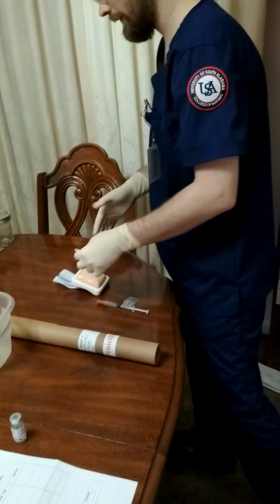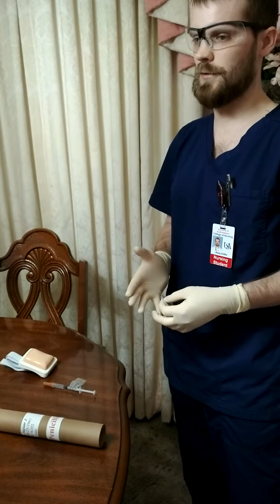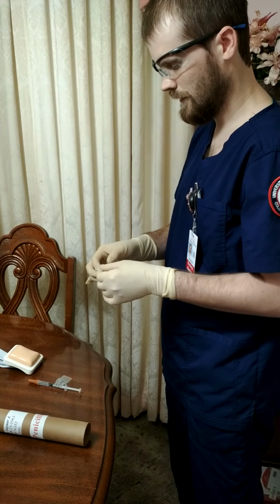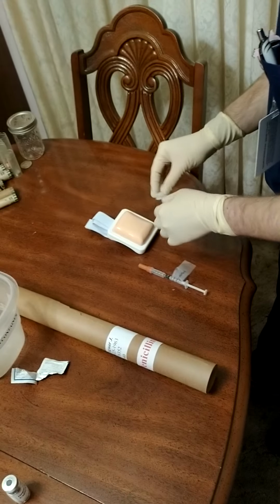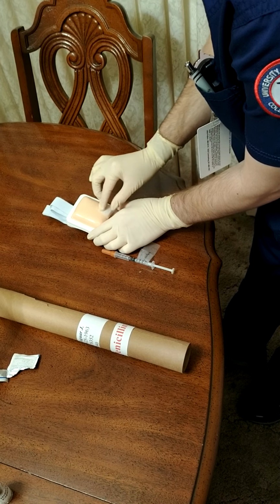So I will find my site, and we will expose the site, but do so in a way to maintain patient privacy. I will then clean the site, starting in the center and going outwards.